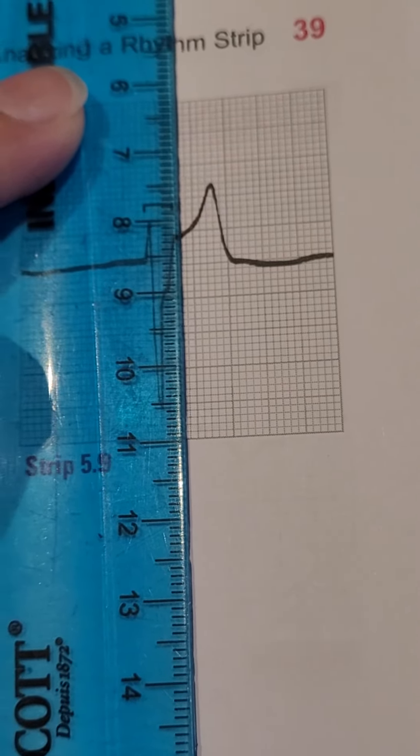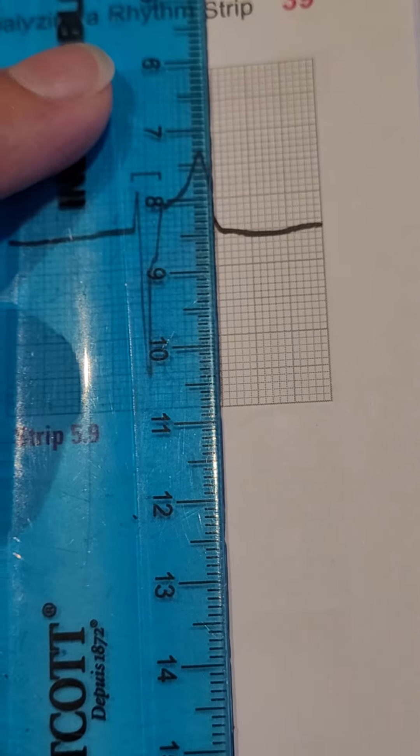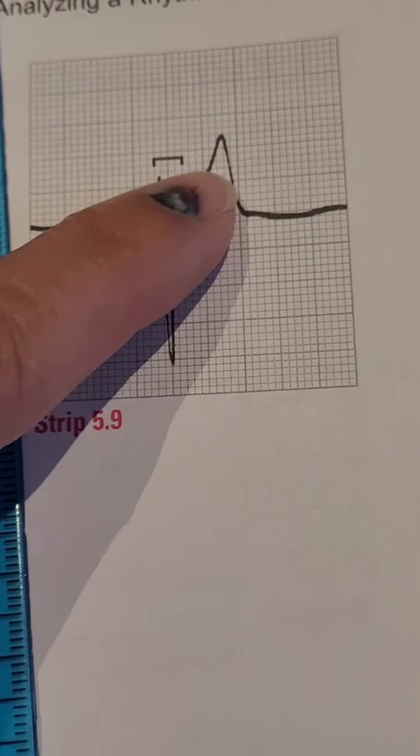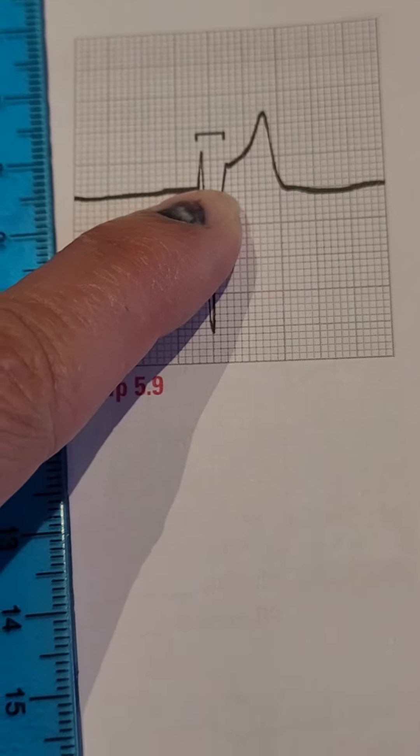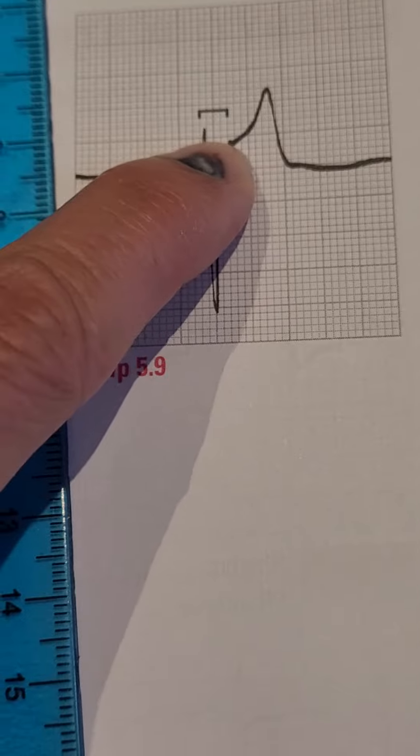You can see that you have your T wave here. So there's some ST elevation here from this isoelectric line up to the J point, which is there.